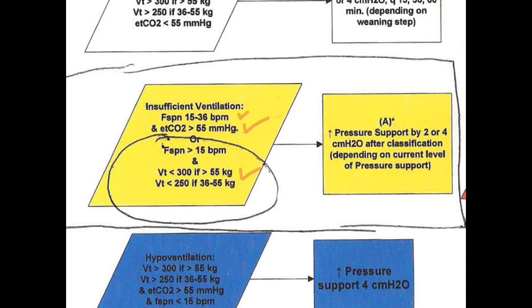So what would we do as a practitioner in this situation? Well, we'd increase the pressure support, and that's what the expert-based rule is doing. As you notice, the machine automatically increases the pressure support by 2 to 4 centimeters of water. That was an example, or a brief introduction, to what an intelligent targeting scheme does.